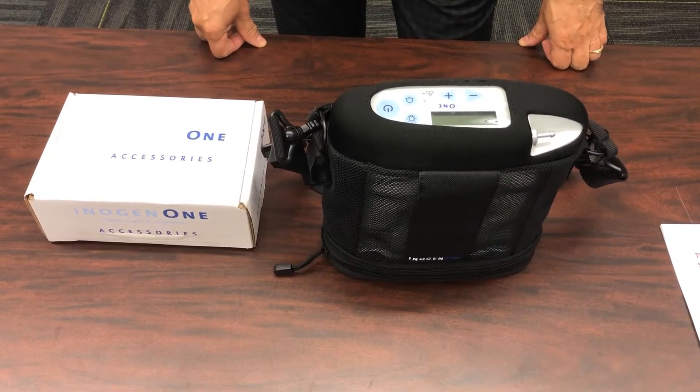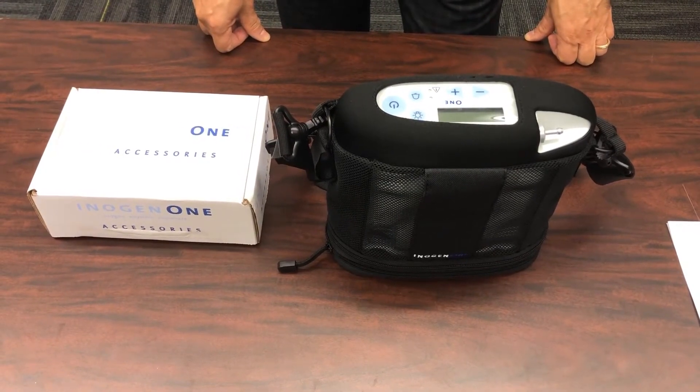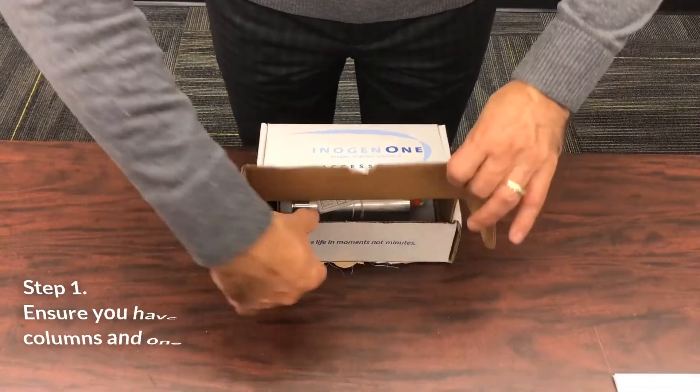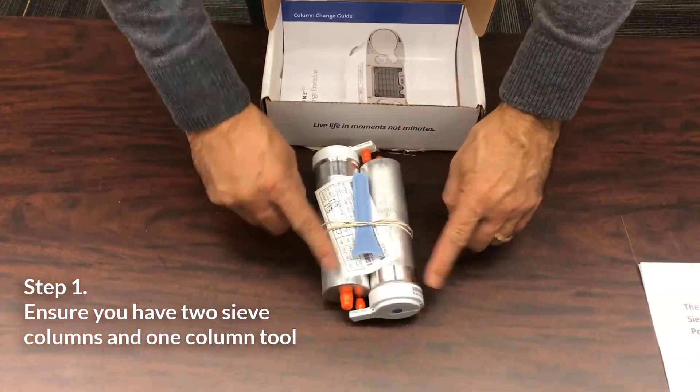The following are the steps to replace the sieve columns in an Inogen One Gen3 portable oxygen concentrator. Open the box the columns came in and ensure you have two sieve columns and one column tool.